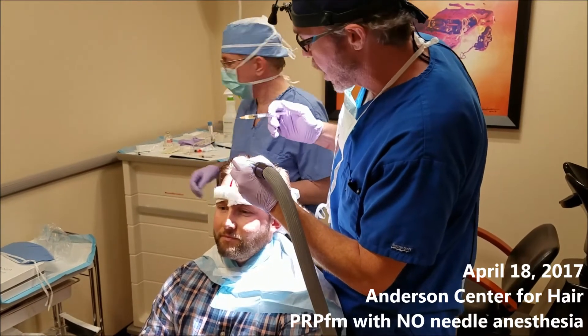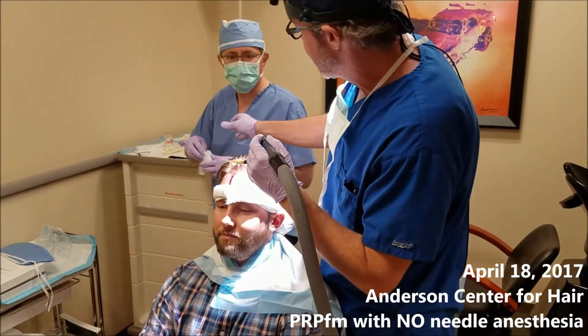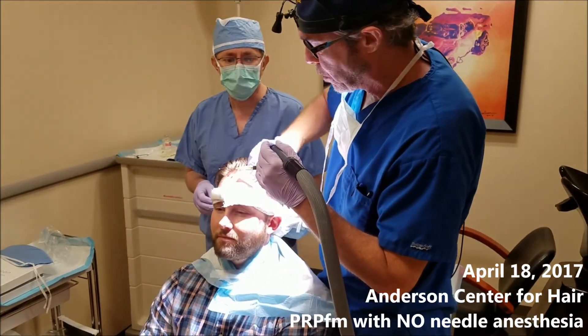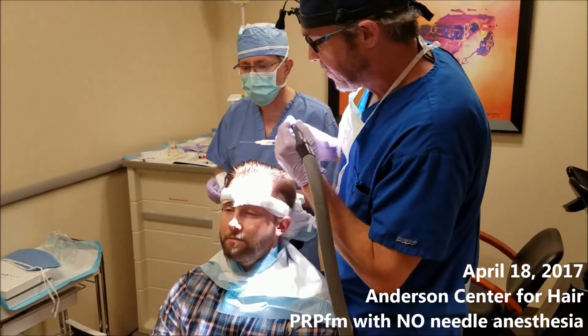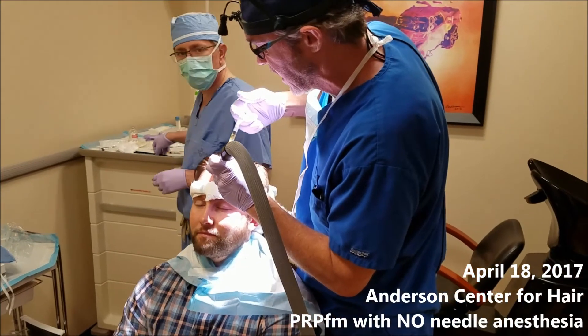A little gauze pad, please. So you stir up a tiny bit of paper-cut minimal bleeding. Almost done, actually — got about four more of these.